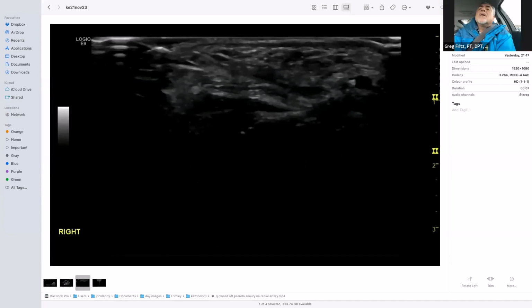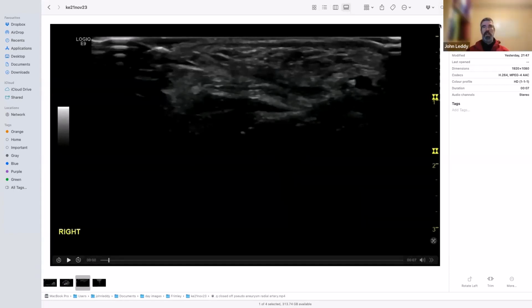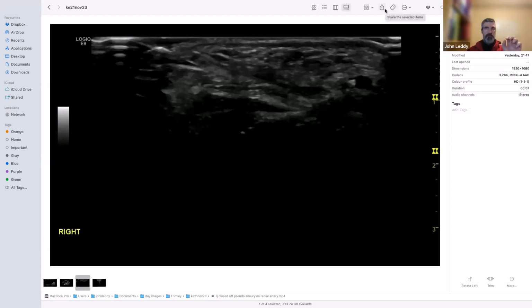It's basically a hematoma of sorts, but an unusual shape of hematoma, probably caused by a burst in the wall of the blood vessel of an artery, and then fluid's been pumped into it, which gives it that big thick wall. As it has closed off, the jet has got smaller and smaller, and so it's just left you with a little bit of fluid eccentrically within the circle. So the fluidy bit isn't right in the middle. It's just off to one side.